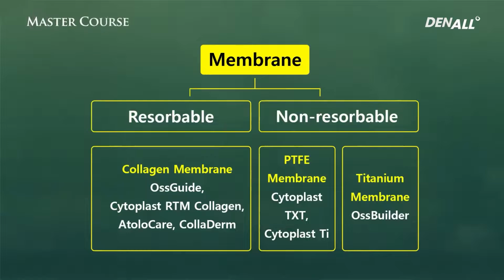Membrane can be divided into resorbable and non-resorbable. I normally use collagen membrane for resorbable membrane. I use Ossguide or Cytoplast. For non-resorbable membrane, I use Cytoplast, and Ossbuilder for titanium membrane.